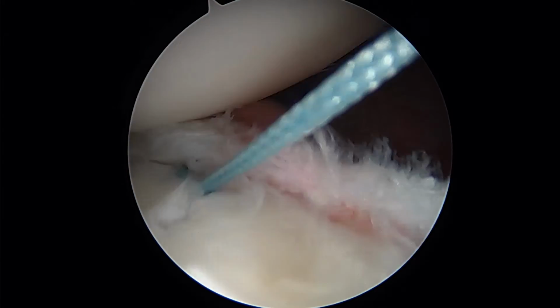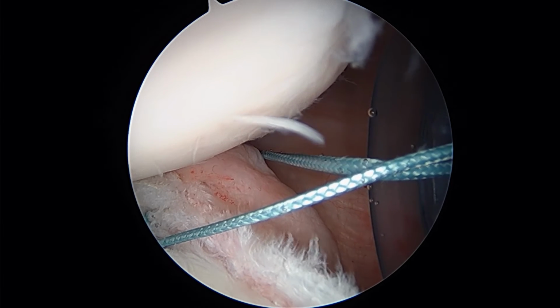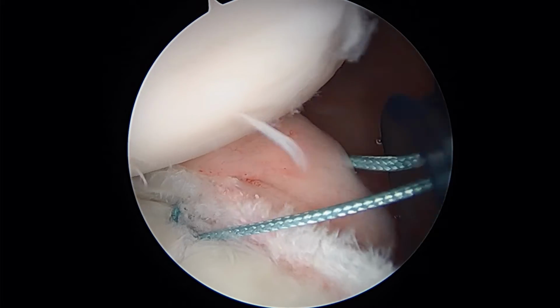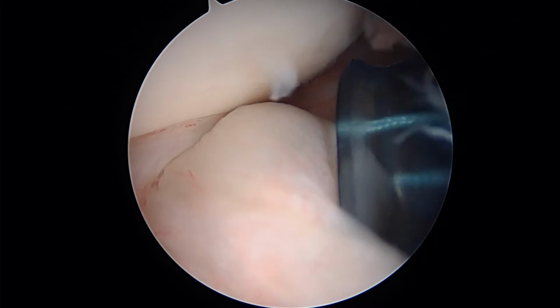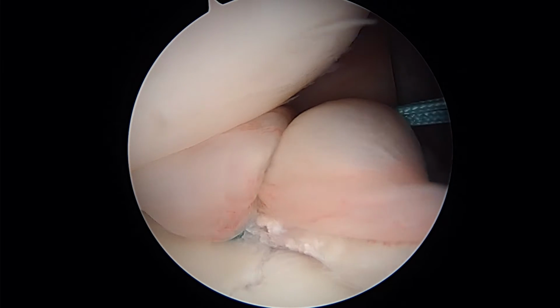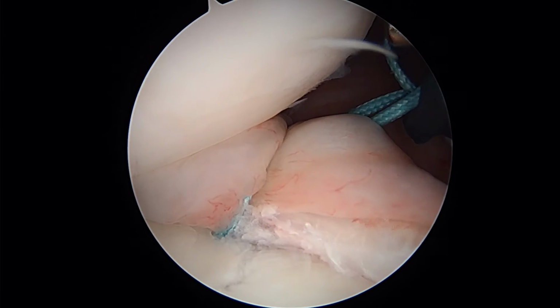Okay, so there's our first stitch. Hold right there. We're going to tie this as an interrupted stitch, which means that's going to be our post. That's this. Okay, good. We've already rasped the capsule, by the way, which just makes it a little sticky so it'll heal well. You can think of that as trying to make it like a piece of Velcro so it just sticks together once we put these sutures in. We're just tying some half hitches here to secure this knot. You can already see how this has tightened up this part of the shoulder.